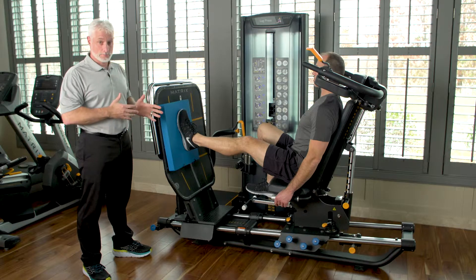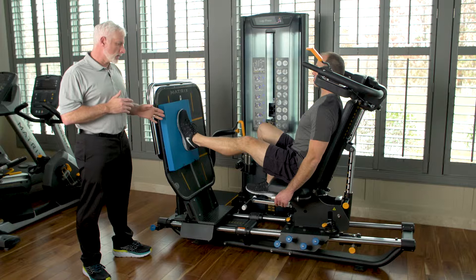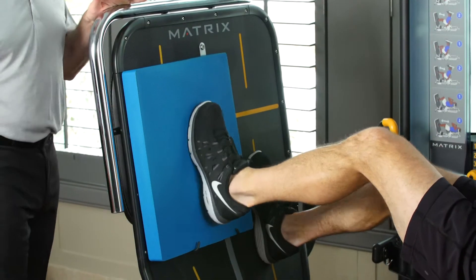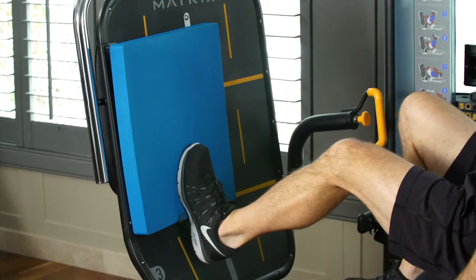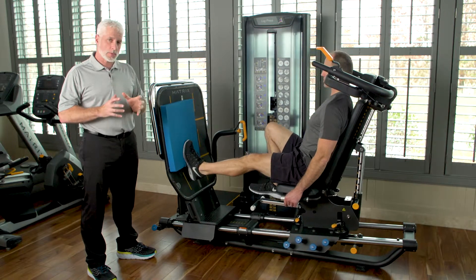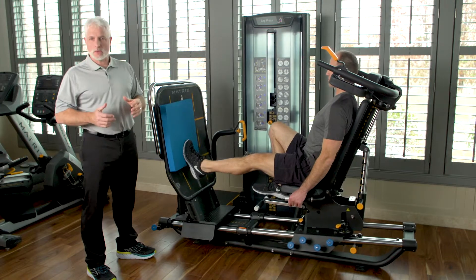What you can also do with the foam — and what's nice about this leg press — is you can do single leg or double leg. You can drop his foot down a little bit so the heel is off the foam pad. As he does that, whether it's a total joint or ankle sprain, he can do calf raises on foam with his knees straight, getting proprioceptive input into the joint distally and working his way up to the pelvis.